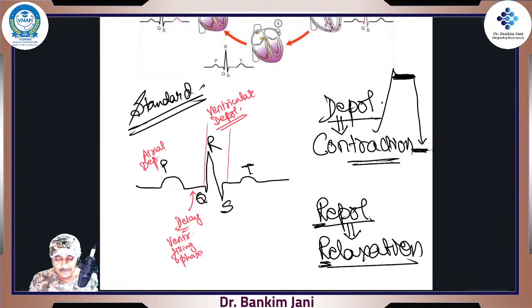Because now the blood has been pumped out, this T wave is ventricular repolarization. If that is the case, where is atrial repolarization? Well, atrial repolarization is buried in ventricular depolarization. So this is atrial repolarization, buried in.